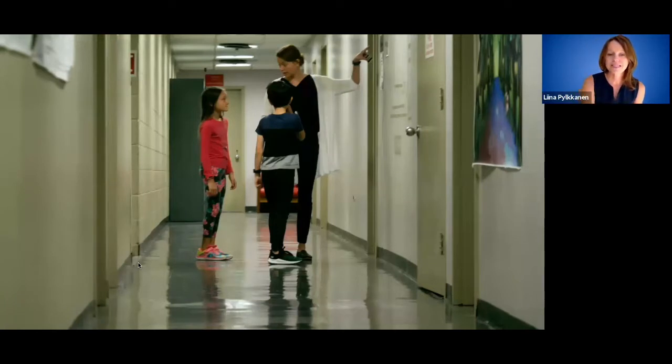So we're going to be visiting the lab with these kids who have participated in our study, and they also are visiting the lab to learn more about MEG and the brain. And so now, just to get started, let's imagine that there's some neural activity, as there should be, in this little boy's brain. And so let's specifically assume that there is a current in his brain that's flowing like this. It's a little arrow that is neural activity, electrical activity, pointing downwards.